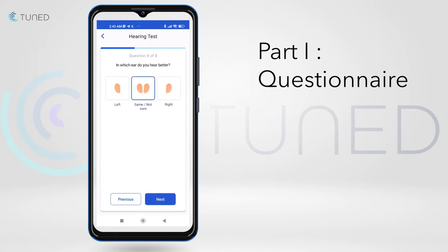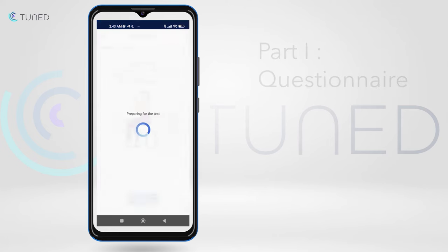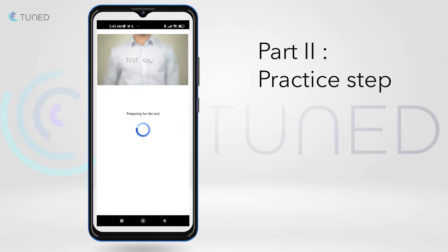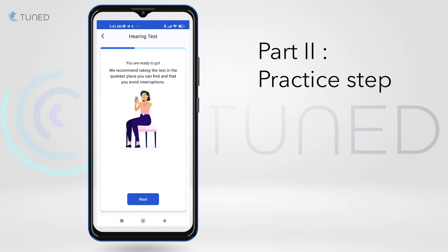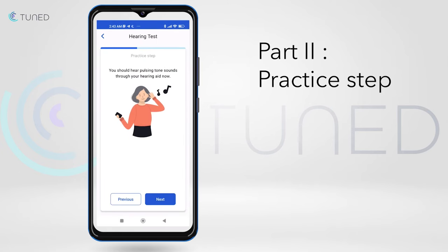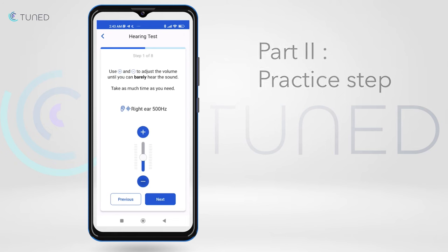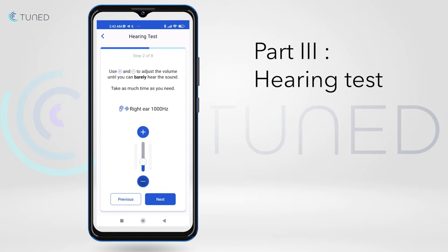After the questionnaire, the user will start the hearing test with a practice step. The goal of the test is to find the hearing threshold for each testing frequency. The user is requested to use a volume control bar to adjust to the point where the tone is barely hearable. Once the practice step is complete, the user will repeat these steps for four frequencies in each ear.